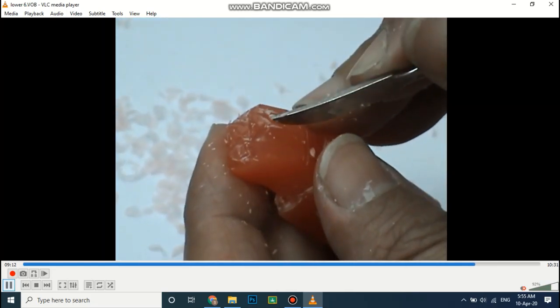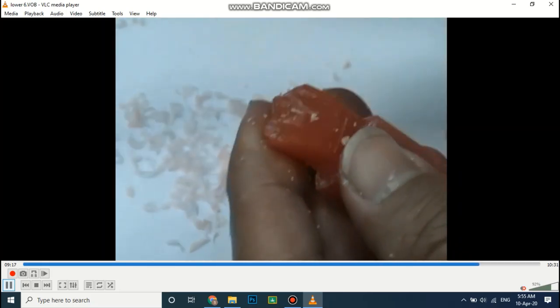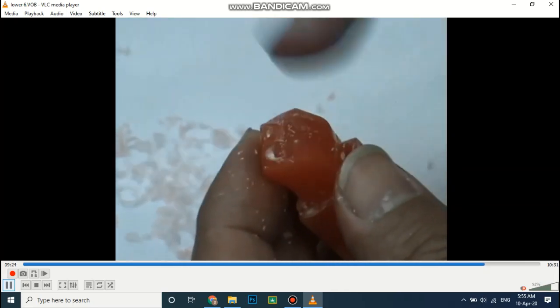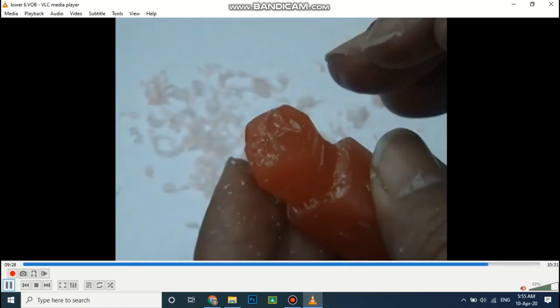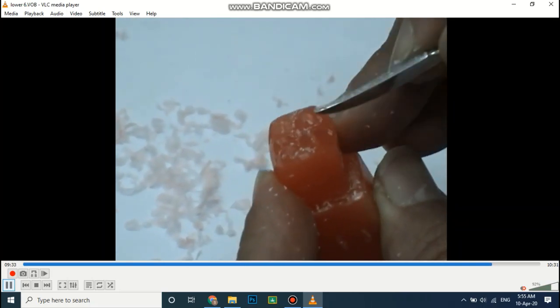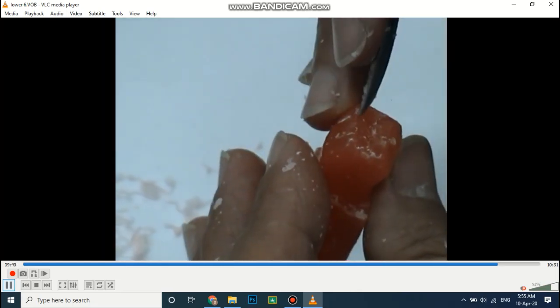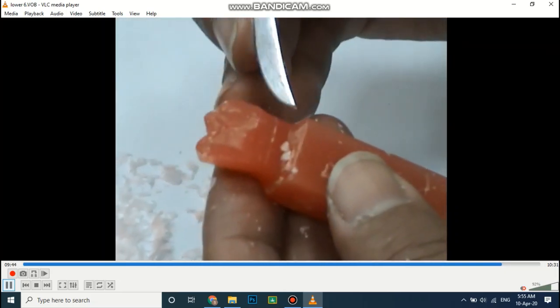Accentuation of the buccal grooves from the buccal surface, just accentuation and flaring to the grooves this way. Gentle reduction of the grooves buccally, and the lingual developmental groove is created. Gentle removal, mesial and distal, to this groove occurs. By this way we have the lingual developmental groove. Removal of any extra wax.